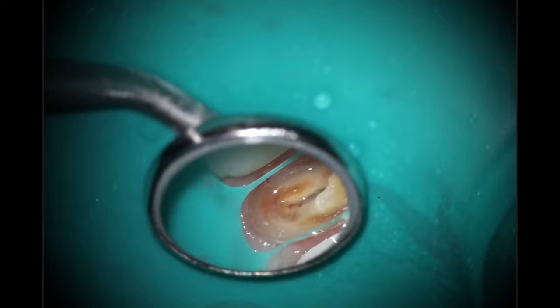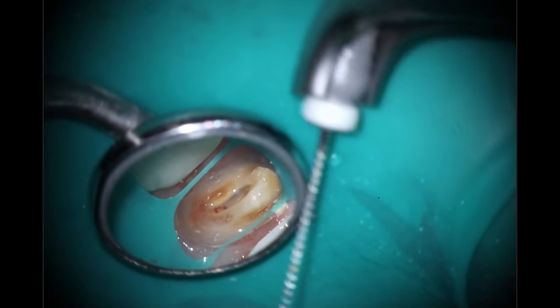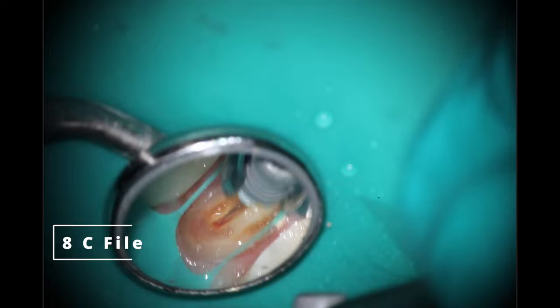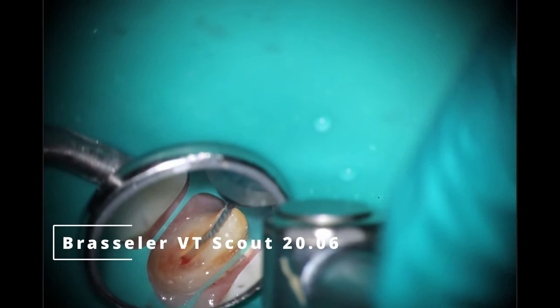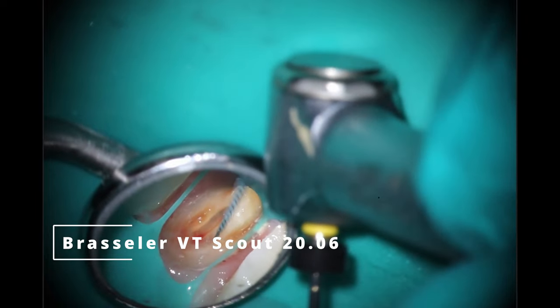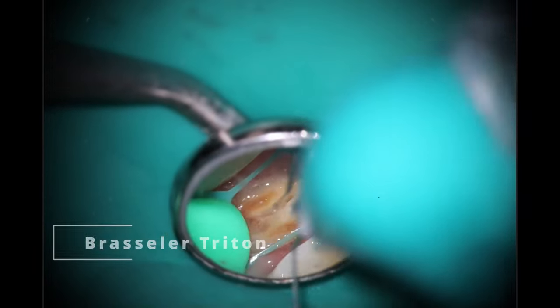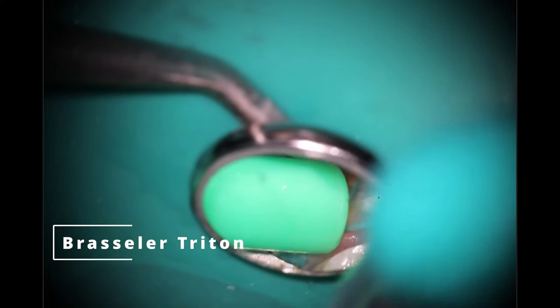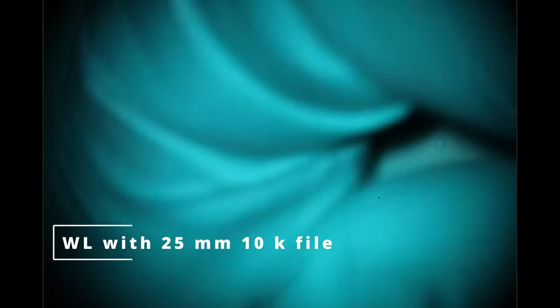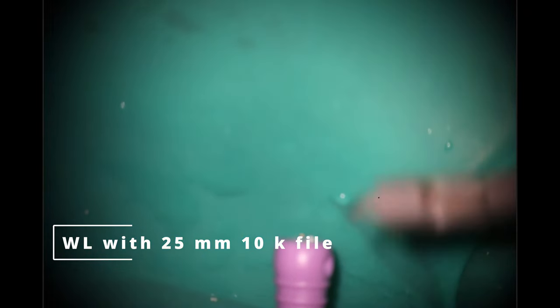So there we are. You can see the tooth is still vital, and she really wasn't having any pain. He wanted to get a couple of posts to help support it and build the tooth back up. Going in right away with that 20/06, getting that coronal pulp tissue out. I have an estimated working length off of the cone beam. Since there wasn't a temporary, I could see exactly where the actual tooth structure was — you can differentiate between the crown, the temporary crown, and the actual tooth. Got both cleaned out and we are at working length — about a minute and a half in, not too bad.